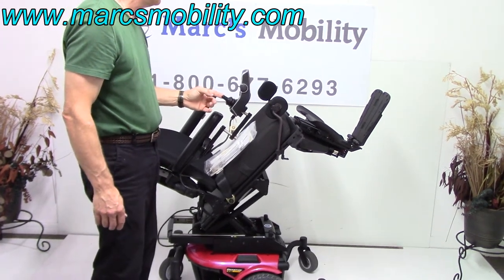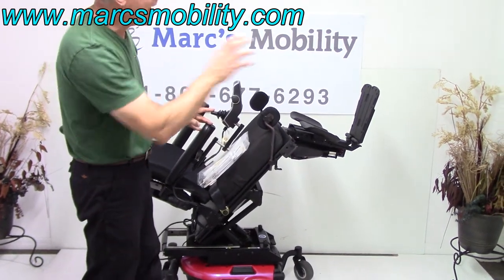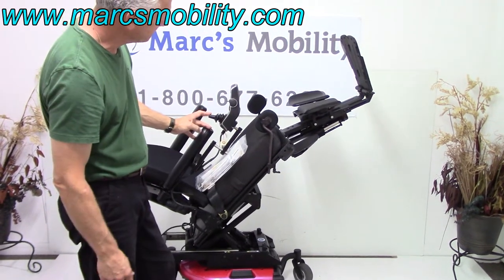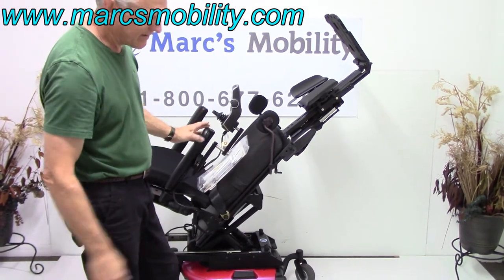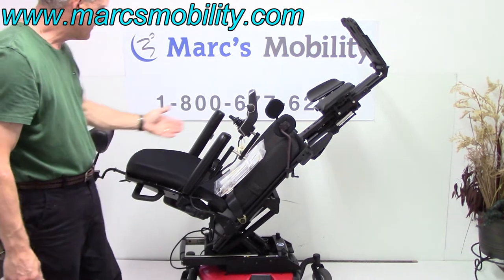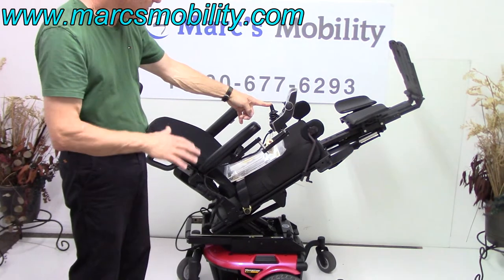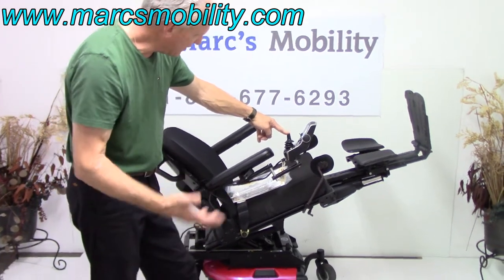I'm going to do the legs now. These legs go up and they go out — all of a sudden you'll see them push out, giving you more room for your legs. There are three motors on the legs alone. So if you want your legs higher than your body, you can do that, or you can just come back down and tilt the legs, or bring the tilt back down to whatever position. You can be tilted halfway with your legs raised — any position you want. You can do anything you want with this chair.